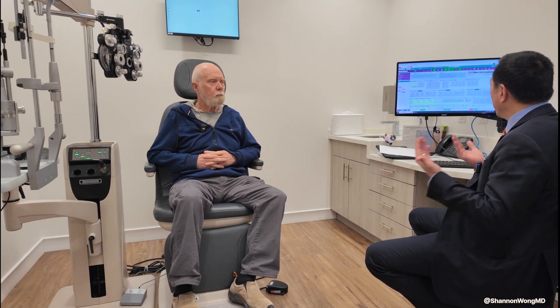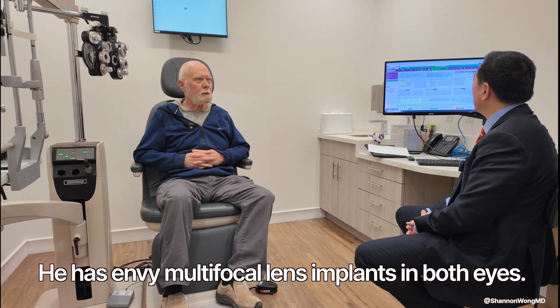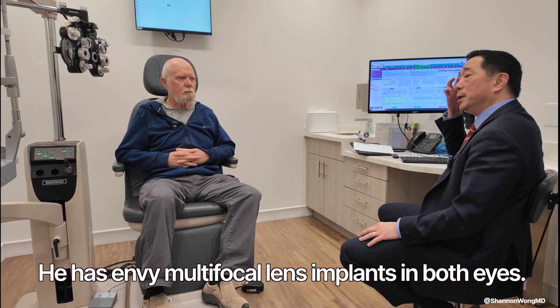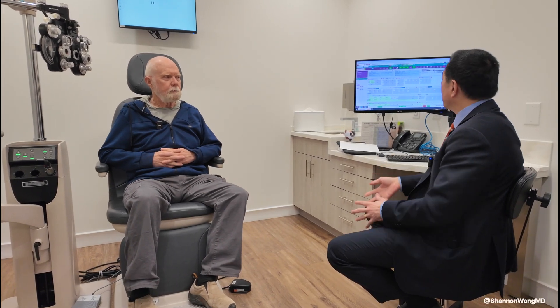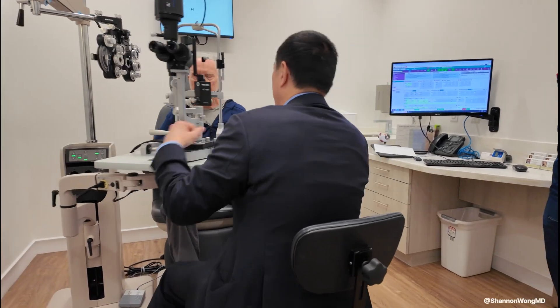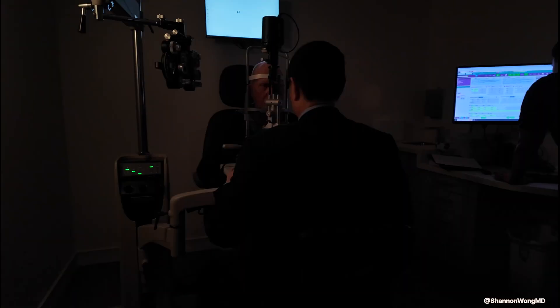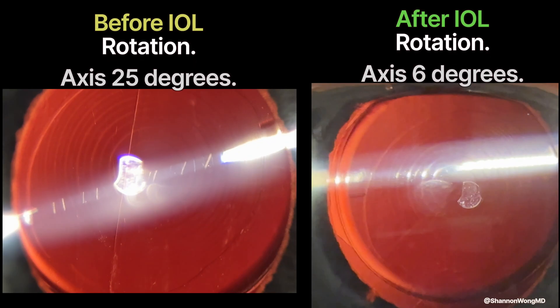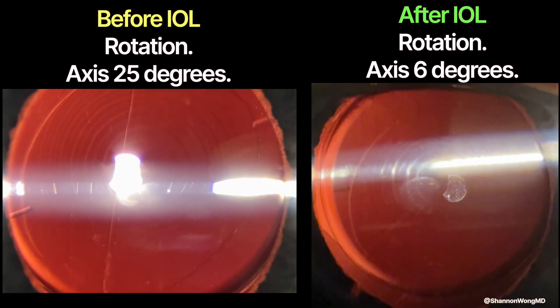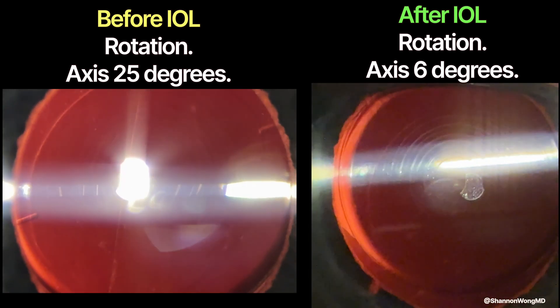How does your right eye compare with your left eye now? This morning the right eye is doing better than the left eye as far as clarity. So just less than 24 hours out — let me take a look at the alignment of your lens implant. Here we can see on the left image the alignment of the lens implant before surgery, and on the right image the alignment after we rotated it back into correct alignment.